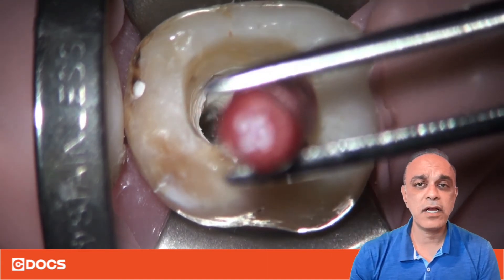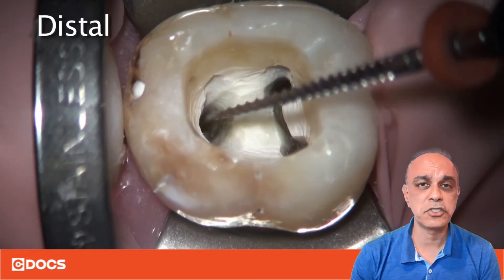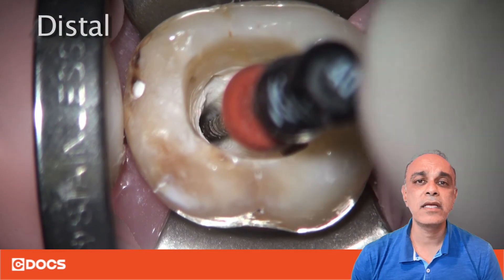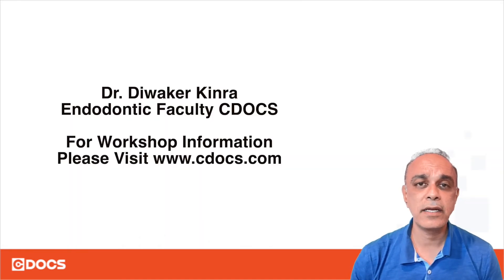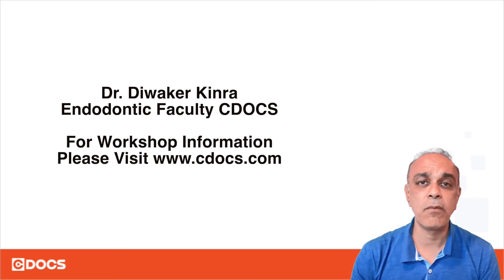After I've done this, I'll go ahead and take a radiograph to ensure that I've done it correctly. At that point I know I'm going to finish with my irrigation, dry it, and then seal it with the accommodating or matching carrier point.